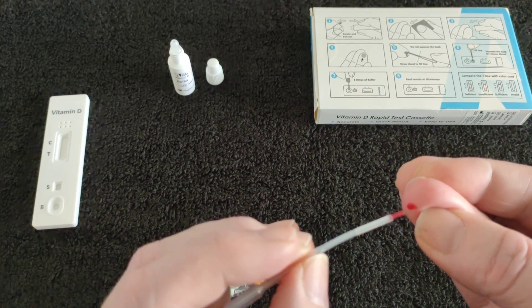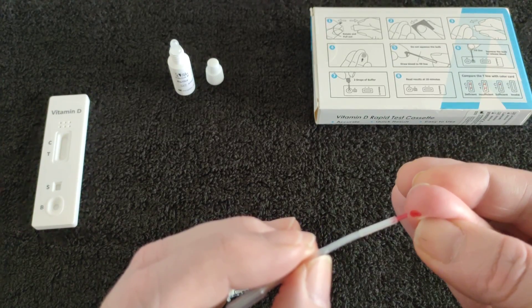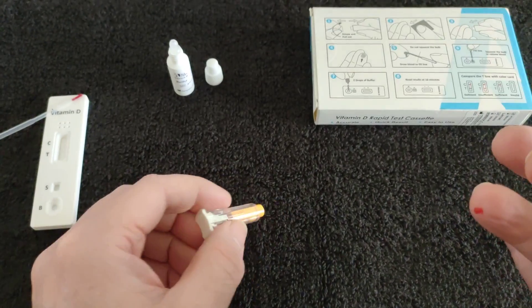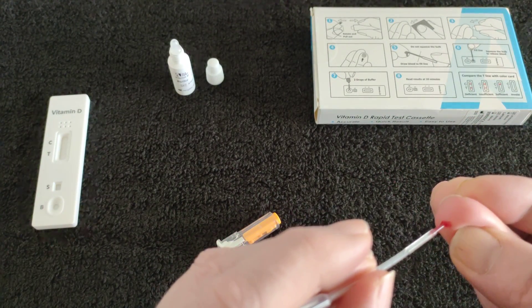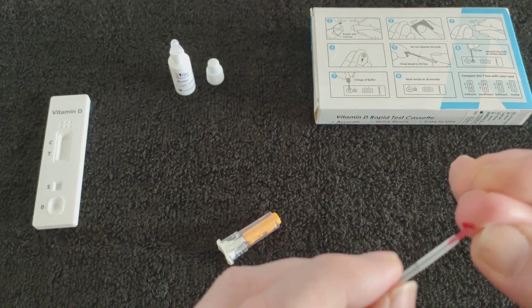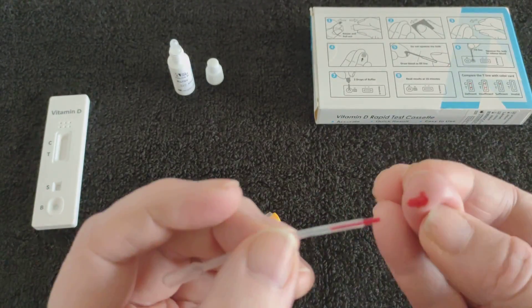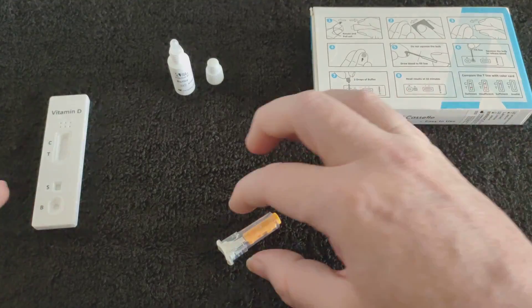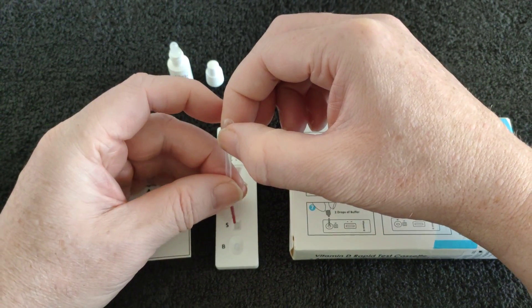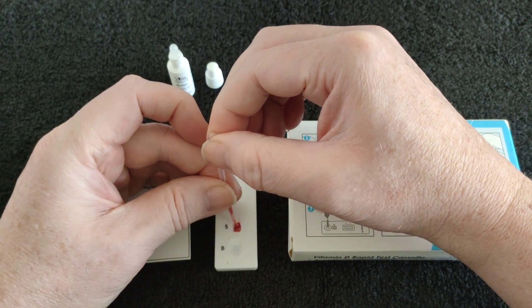I don't think I can use the jag again. I'll give it a try. Nah, it's gone — you only get one shot. I'm just going to go with that; I don't think I'll get anymore. You put it in S and you use the bulb to squeeze it. Said no air bubbles but — oh well, more mistakes.